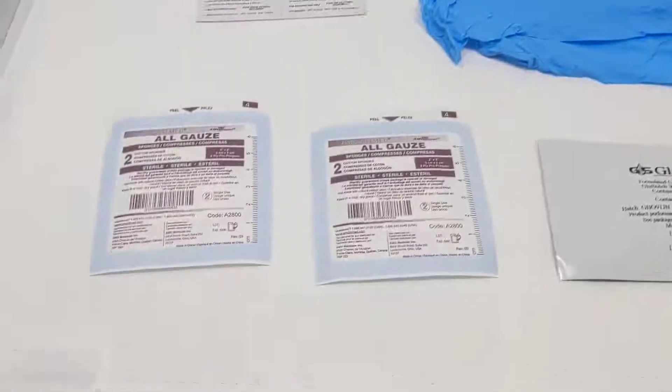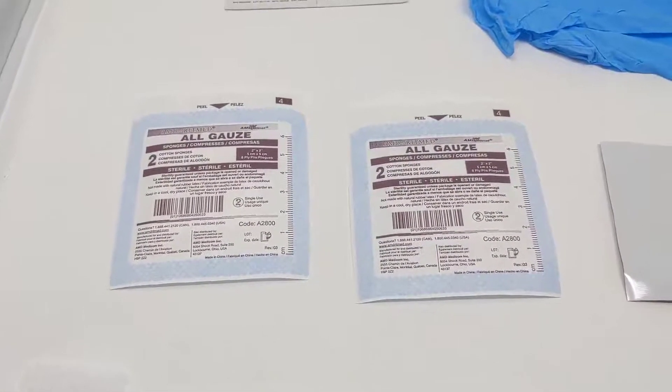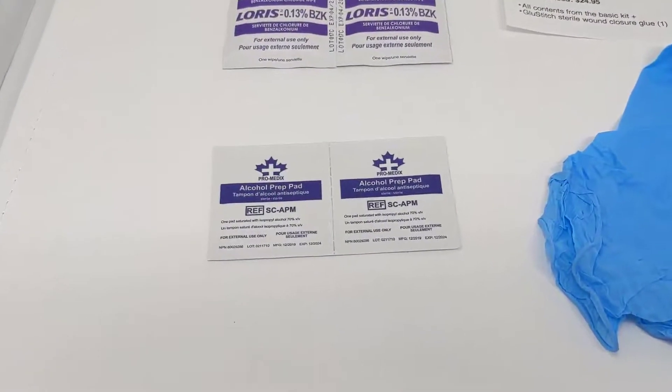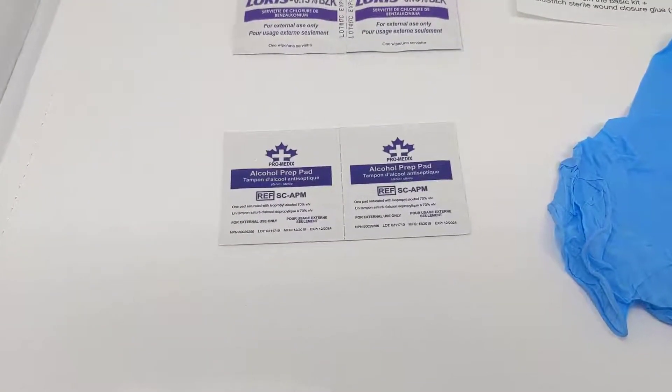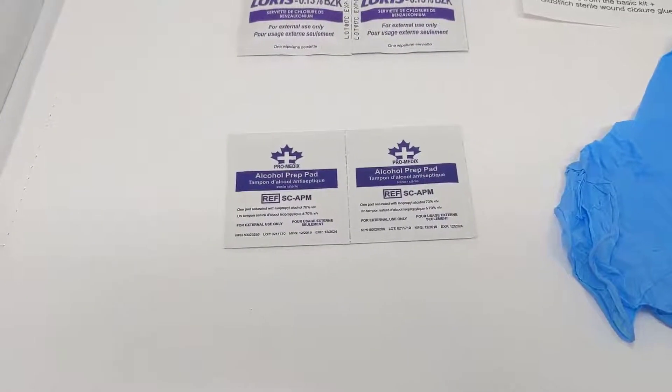So the kit's going to come with two 2x2 gauze pads to control the initial bleeding and clean off any blood and debris. Then you have two alcohol prep pads to prep the skin around the laceration to remove the oils so that the Steri strips and the glue adhere better.